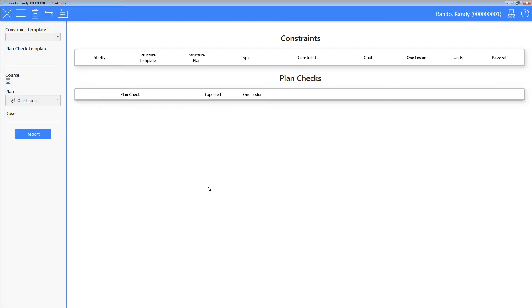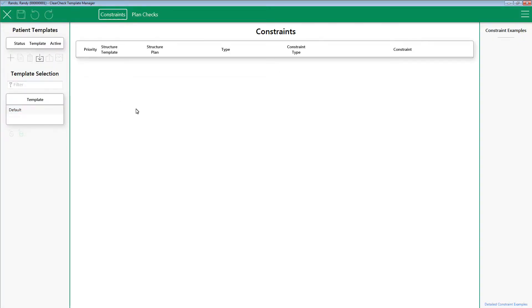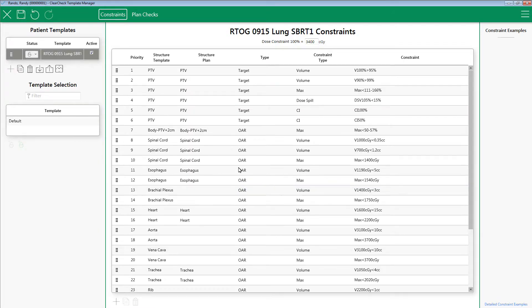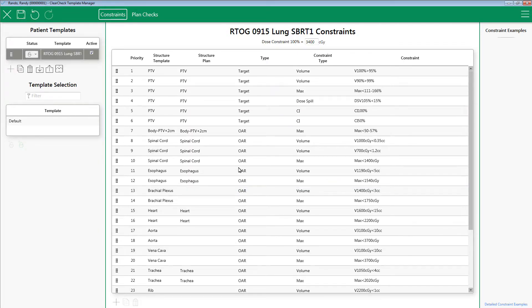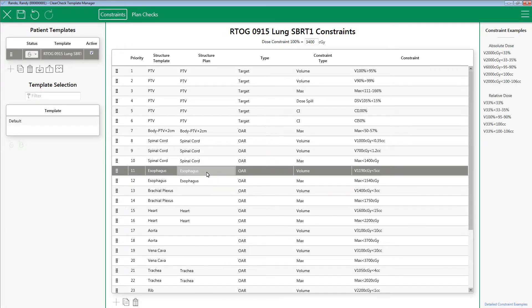Next, open up ClearCheck with the patient you want to apply the constraint template to. Click the Patient Template Manager. From here, click the Import icon located here. Browse to where you saved the constraint template file, then click Open. That's it. You now just imported the constraint template into ClearCheck. Next, verify that the constraints are correct. At this point, feel free to edit the template name, add constraints, edit constraints, or whatever else you deem necessary.